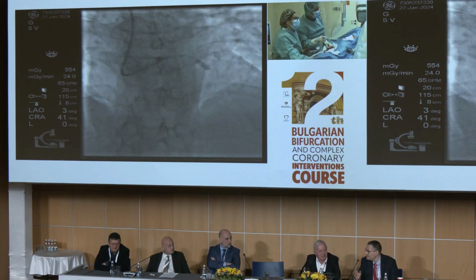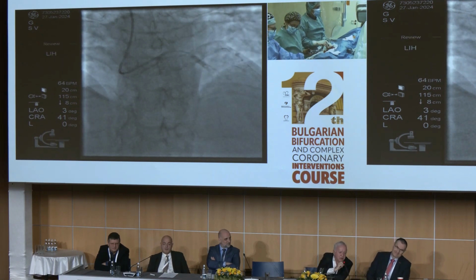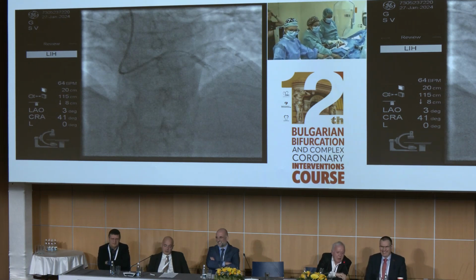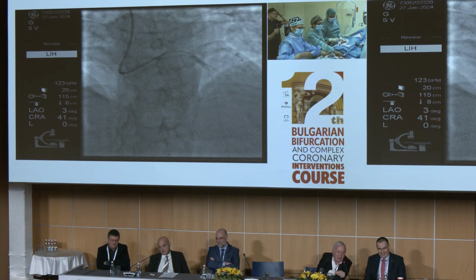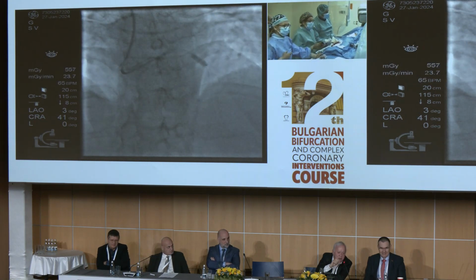Test now? Still, yes. So, what is it, a non-compliant? Yes. So you see, semi-compliant. We're at 14. This one is a semi-compliant. So what you can do is increase the pressure a bit.